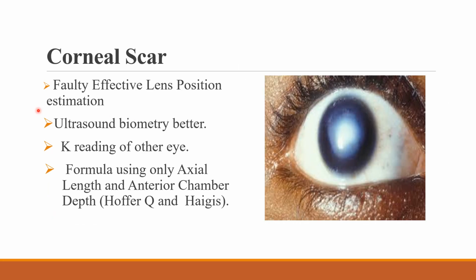Corneal scar. Faulty effective lens position estimation. Ultrasound biometry is better. Reading of the other eye. Formulas using only axial length and anterior chamber depth, that is Hoffer-Q and Haigis.